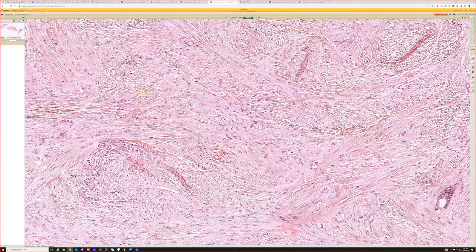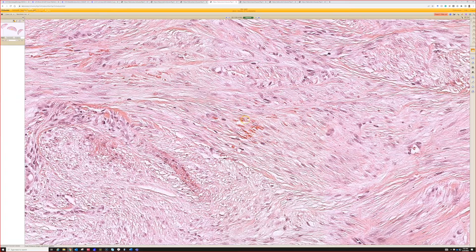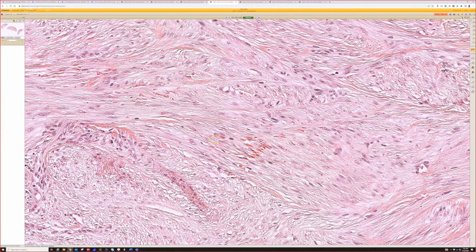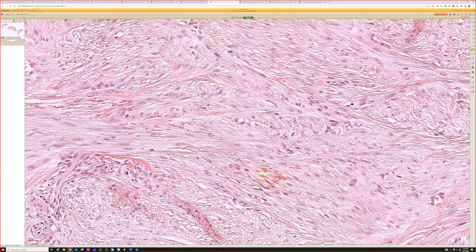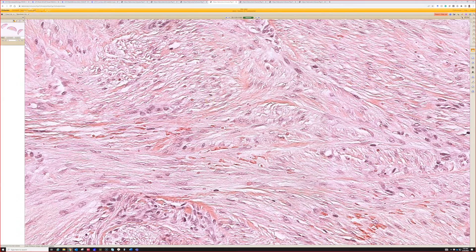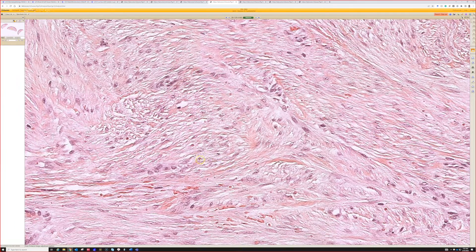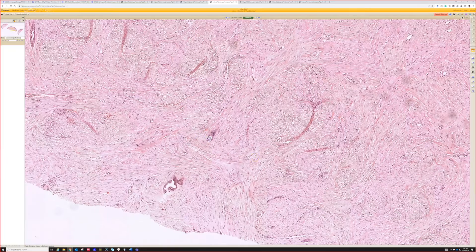One pitfall: when thinking about this entity — a bland spindle cell lesion on the digit of a child — extravasated erythrocytes can sometimes mimic the inclusion bodies. Right here those are clearly red cells, and these are inclusion bodies here and here, but in some areas you could wonder whether it's a red cell or an inclusion body. That's something that can occasionally trick you.